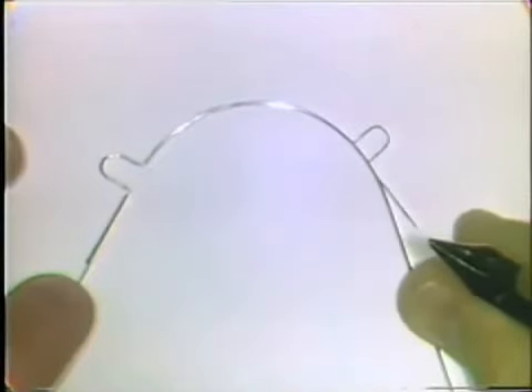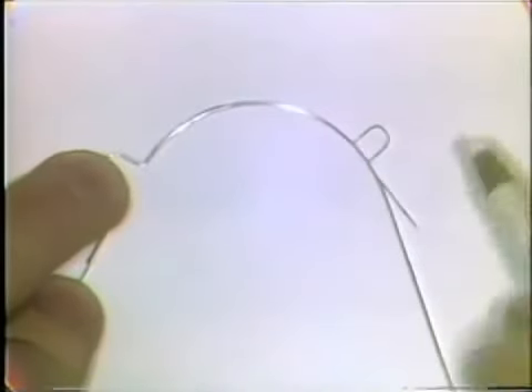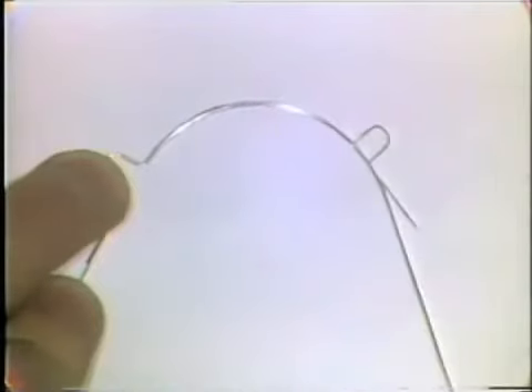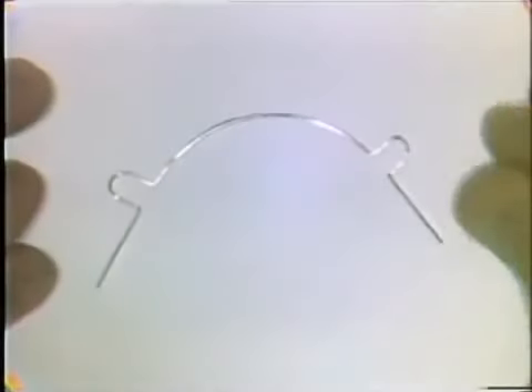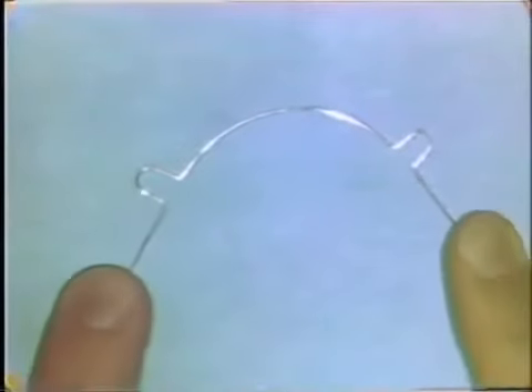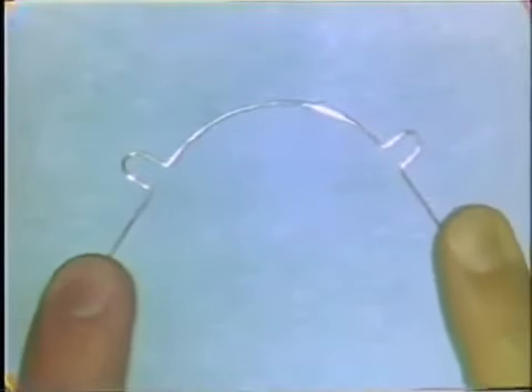The second loop is constructed in exactly the same manner. You start with a mark on the main wire where the first half of the loop is to begin. The completed wire fits exactly over the lines of the pattern and is free of nicks and surface defects, and it should be flat on a flat table surface or glass slab.